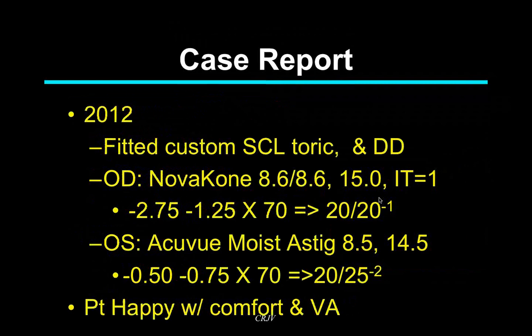So in 2012, he came back. I have been seeing this guy over the years. I saw him again yesterday. Made me think of him for this particular presentation. He came in 2012, and this is when the Kerasoft and Novacones were coming out. So I fitted him with a custom toric, a Novacone, in the right eye and a daily disposable in his left eye. The Novacone was an 8.6, 8.6, 15 and IT1. These parameters gave him good vision, 20/20 -1. AccuView moist on his left eye, 20/25, and he's happy and comfortable.